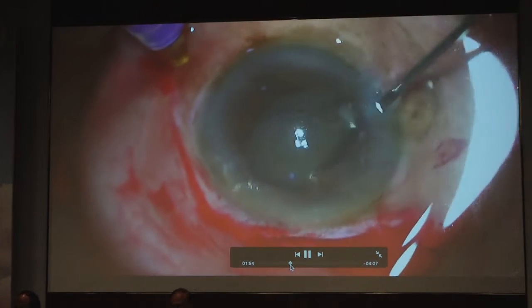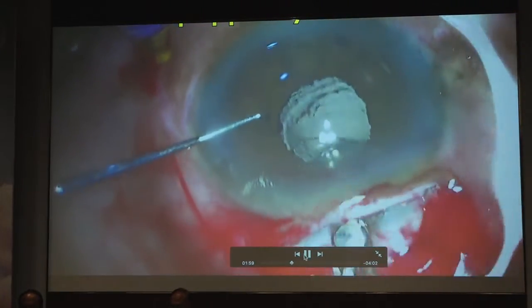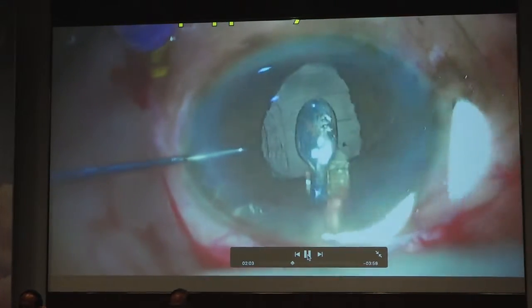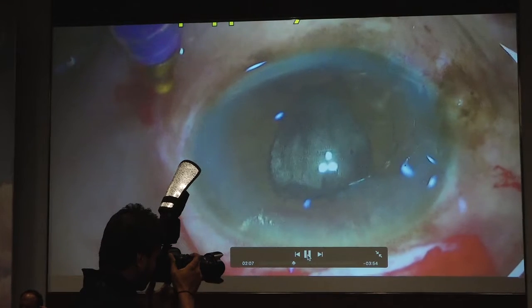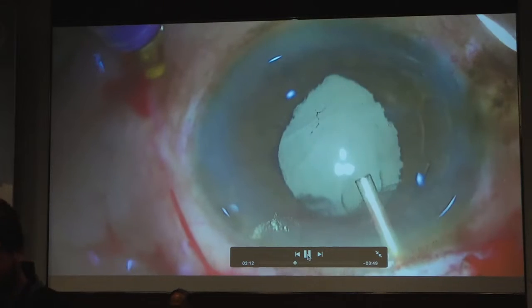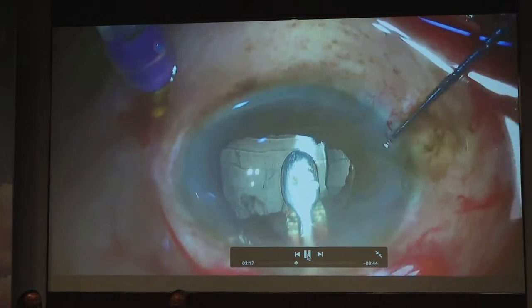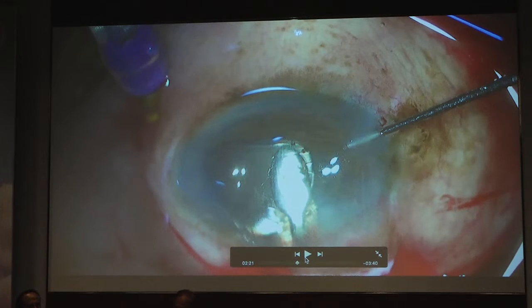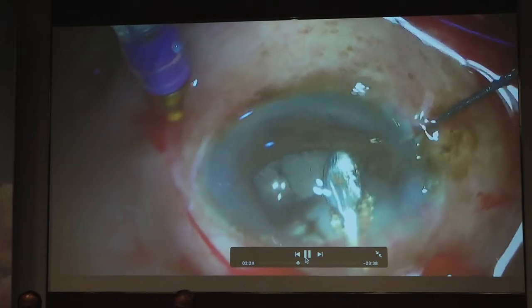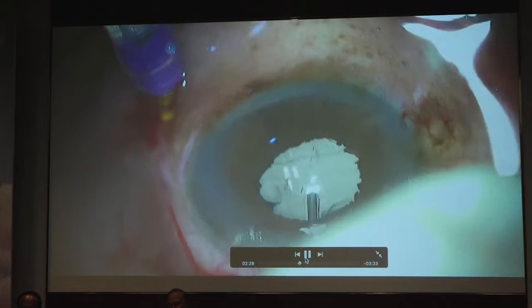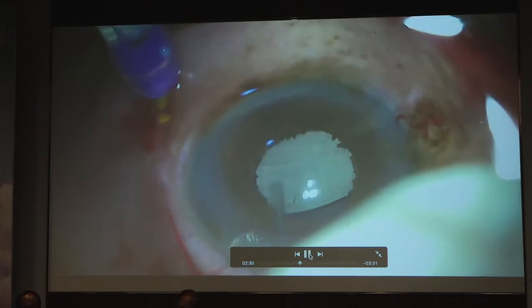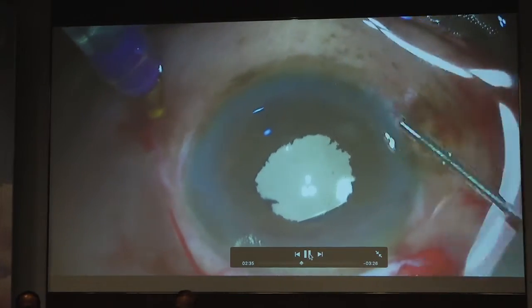For retro-pupillary iris claw lens placement, the second-hand instrument is inserted first to mark the clipping area, then the lens is introduced. The hand holding the IOL is lifted while the left hand pushes down to maintain position during clipping. Broad forceps (shepherd or iris claw forceps) are essential — normal IOL forceps cause the lens to slip. Clipping at the mid-periphery gives a round-oval pupil; going too anterior gives a cat's-eye-like pupil; going too posterior may cause bleeding. Iris claw lenses are one of the best options for aphakic patients.